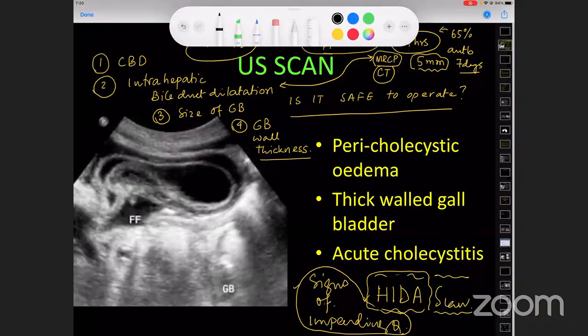Sorry to barge in again. If you get to see an air bubble inside the gallbladder, because we surgeons want to have something, whatever you see, we believe. Do you think that you will suggest the patient for a CT scan? Yes, we will, because air-forming organisms, like emphysematous cholecystitis, can also cause air inside the wall of the gallbladder or inside the lumen, right? Exactly.